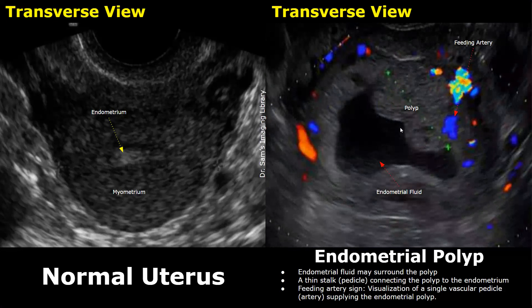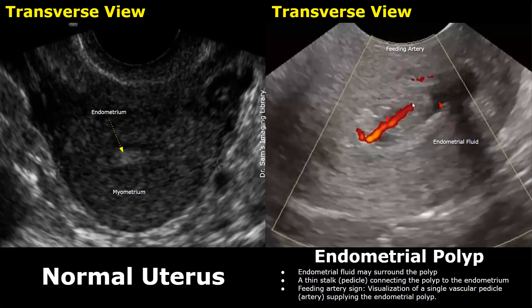Here we have another image showing an endometrial polyp. It is surrounded by a larger amount of endometrial fluid. This mass is larger and there is a single artery seen entering the polyp — this is the feeding artery sign. The feeding artery sign and pedicle are also present in this next image, with a single artery entering the polyp, and some endometrial fluid around the mass.